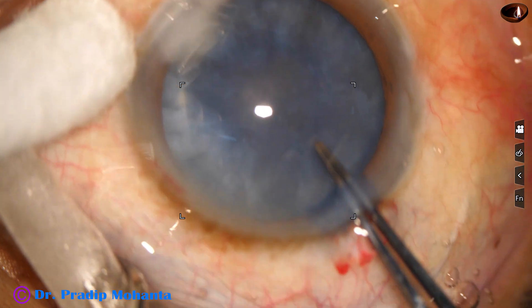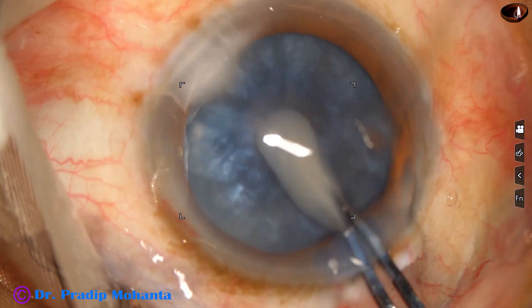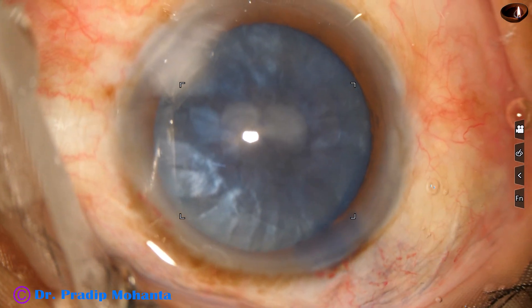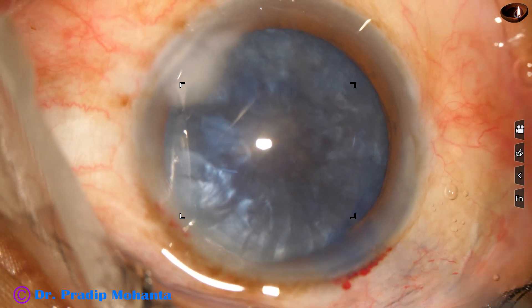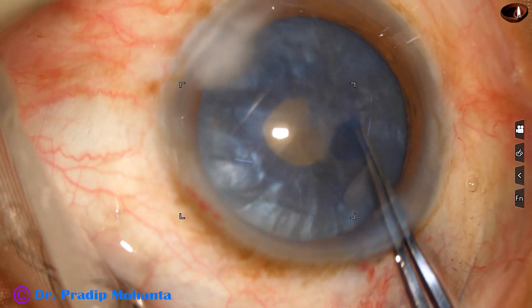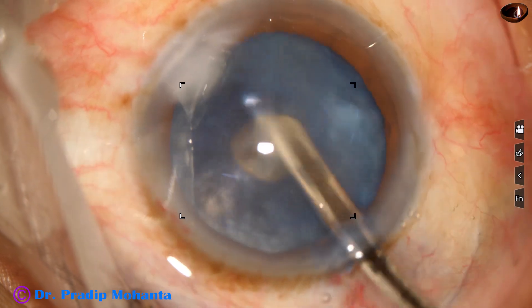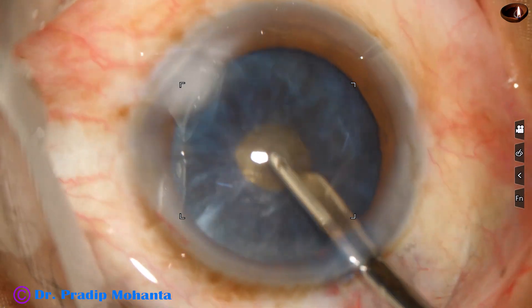As I make a puncture at the centre of the anterior capsule, there is some milky fluid coming out, which means this is a hypermature Morgagnian cataract. Aspirate some milky fluid and then inject some more HPMC. To aspirate some more milky fluid, I convert the puncture into a small rexis first, because the capsule may run to the periphery if we don't do this. Now I aspirate the milky fluid as well as some cortical matter to decrease the intralenticular pressure.